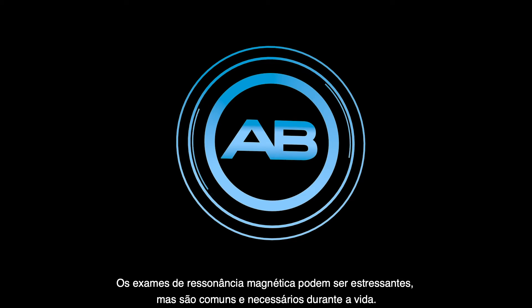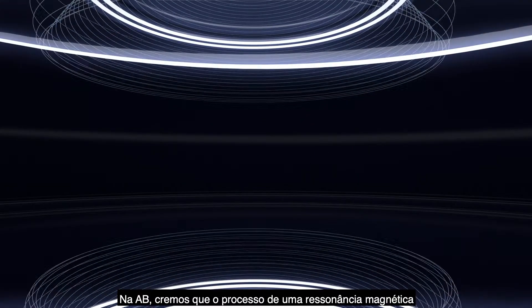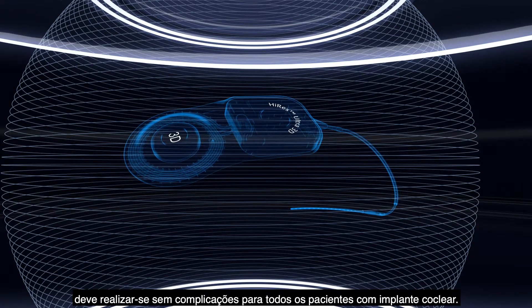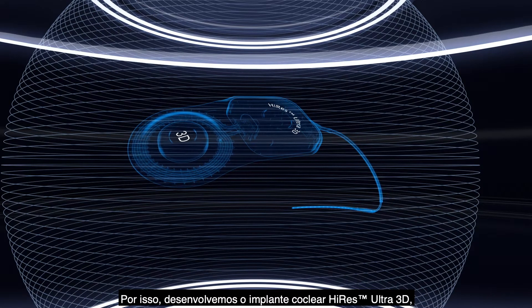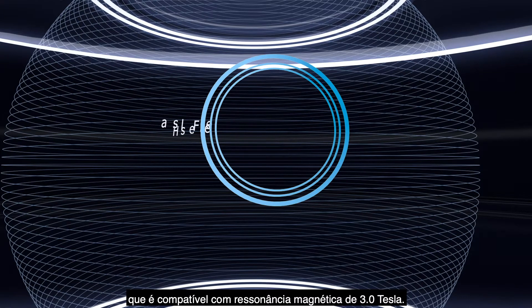MRI examinations can be stressful, but are a common and necessary part of life. At AB, we believe that the process of MRI should be hassle-free for all cochlear implant patients. That is why we've developed the Hi-Res Ultra 3D Cochlear Implant, which is compatible with 3 Tesla MRI.